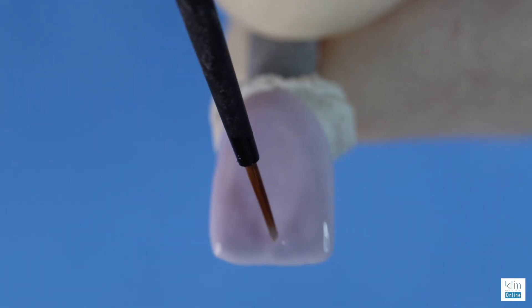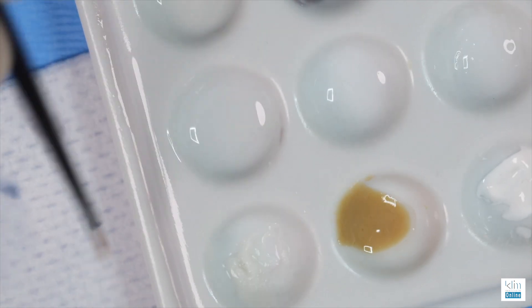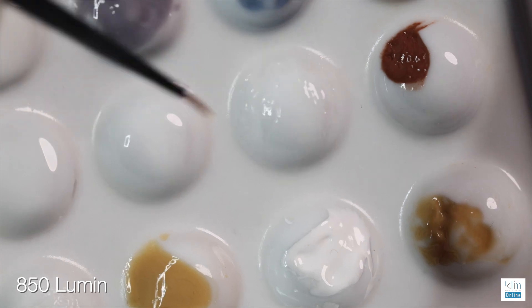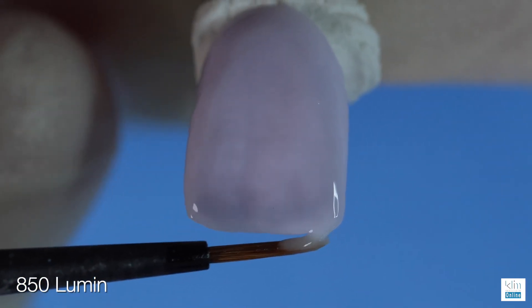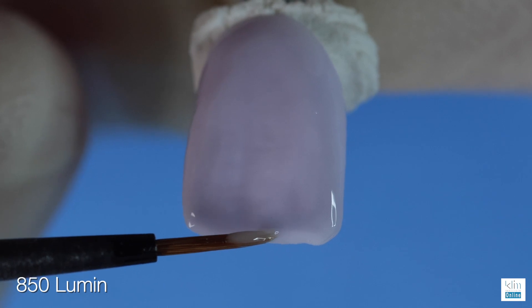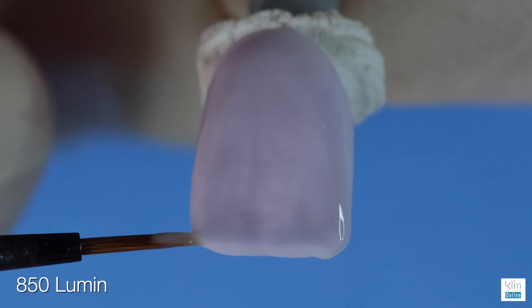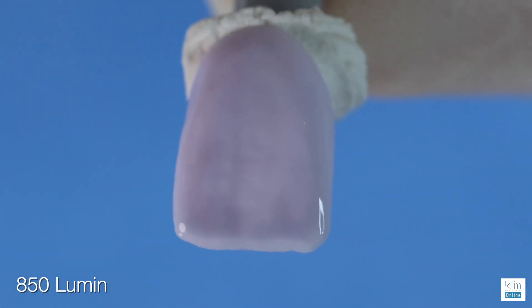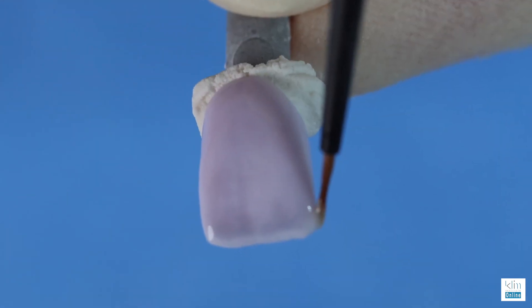As we start to see already, we see the halo effect with the low value. Lumen or Halo Spring will also enhance the halo effect. We're going to add along that incisal edge — use that surface tension in the brush and just barely stroke it across the incisal edge. This technique will just slightly enhance the halo, and around the line angles when the case demands it, you want to keep it really thin. That's already starting to look great — wait until you see the final effect.